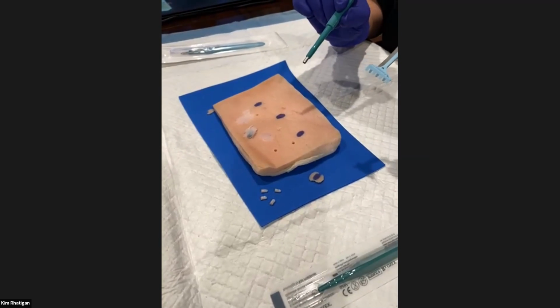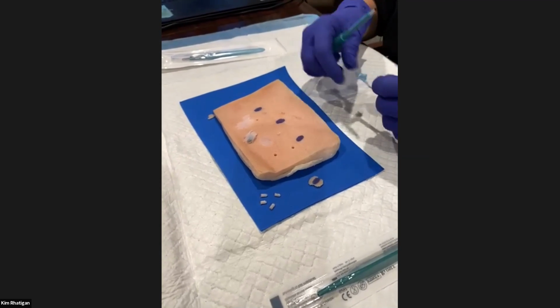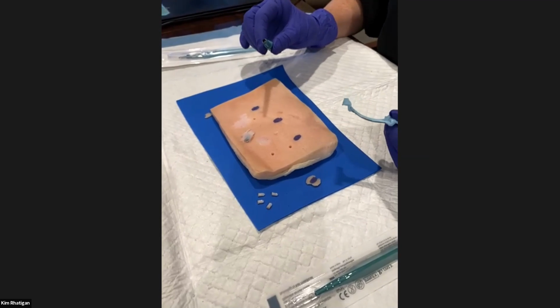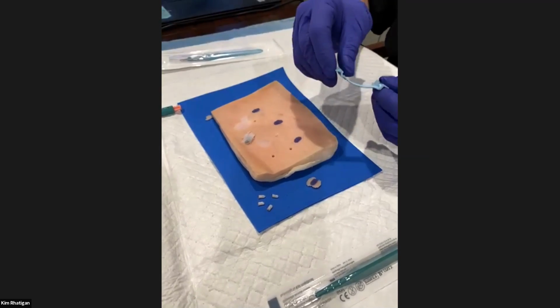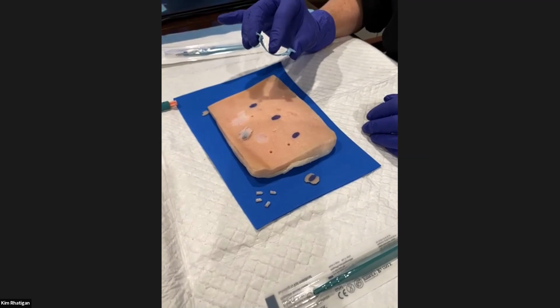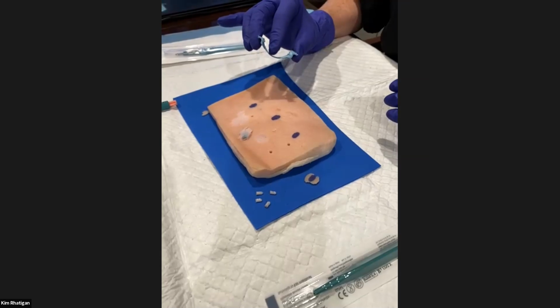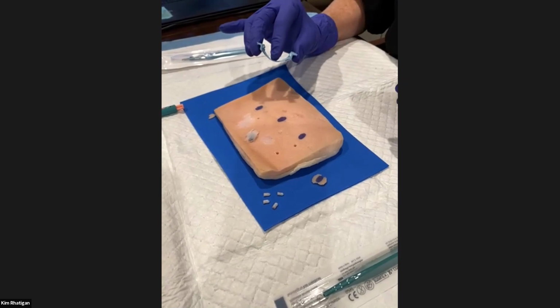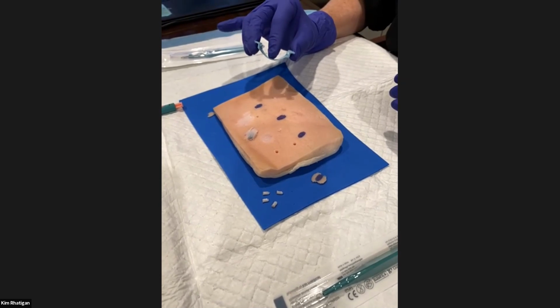Well, on the sole, the epidermis is maybe up to 3 millimeters thick, so you may have to aim quite deep in order to get into the dermis. So a punch biopsy or a scalpel may be a better tool. If it's on the top of the toe, for example, where you don't want to go deep, or over a joint, a shave biopsy may be a better approach. You have to think about damaging nerves underneath. What's underneath that tissue, right?